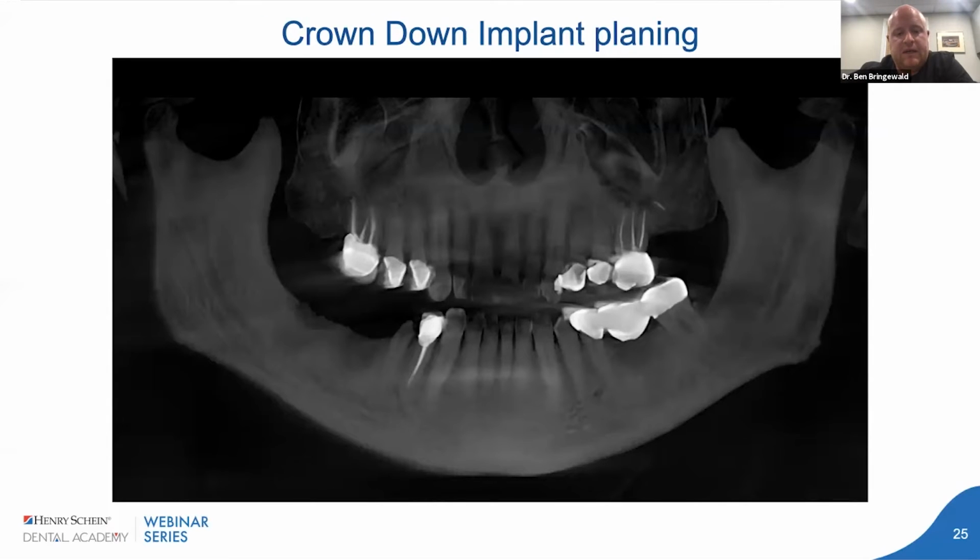This patient came in, had a bridge. Tooth number 29 through 31 was the original bridge. The bridge was failing. The tooth number 31 had fractured underneath the bridge. We sectioned the bridge initially. Tooth number 31 was removed, and tooth number 29, when the patient came in to get his crown done there, he was asking how he can get some teeth back in that area there.